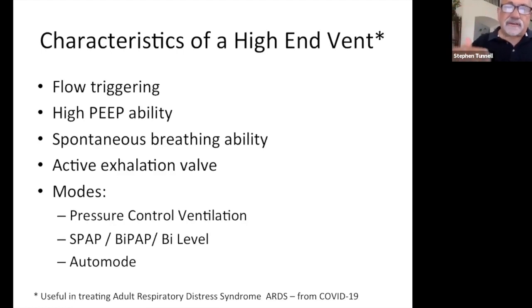And in order to do that, PEEP, not letting them fully empty their lungs, is essentially created by having that valve shut before the patient reaches ambient pressure. So PEEP is the level above ambient pressure that the circuit is maintained at. So if a circuit becomes disconnected, you'll have gas kind of flowing in the room, and that's coming from the PEEP, from the fact that we keep the circuit above ambient pressure.